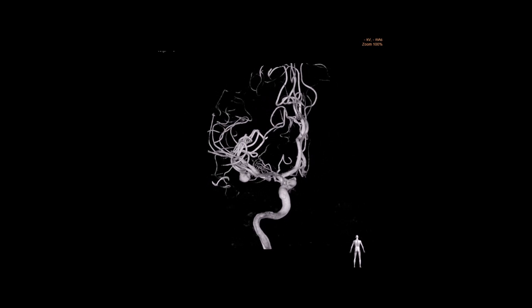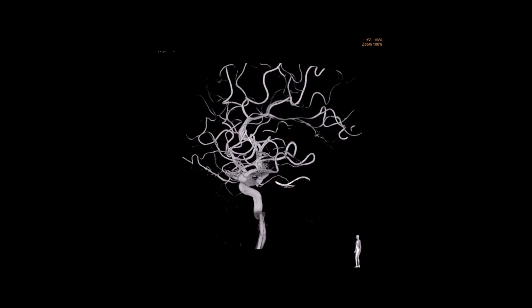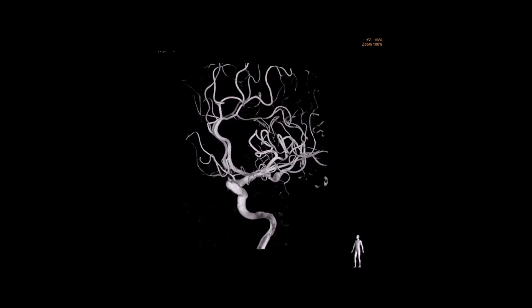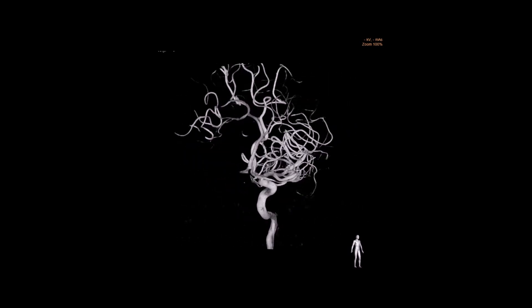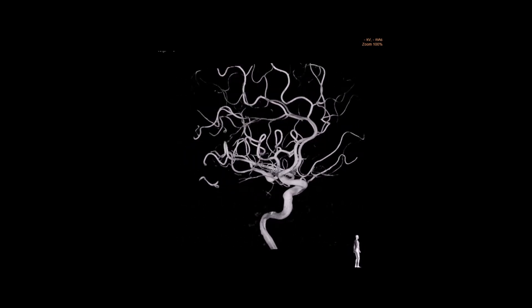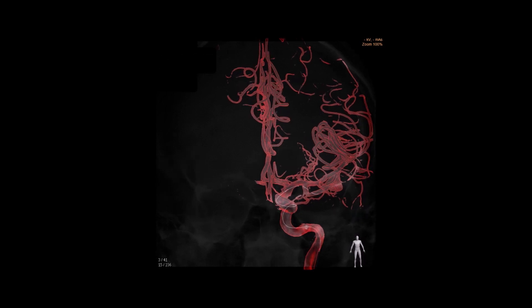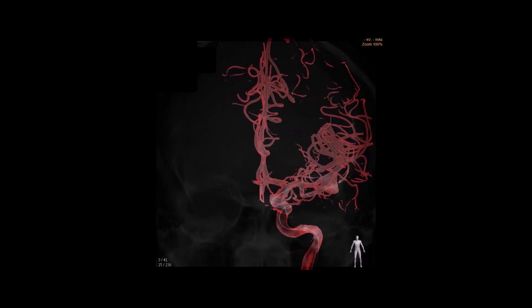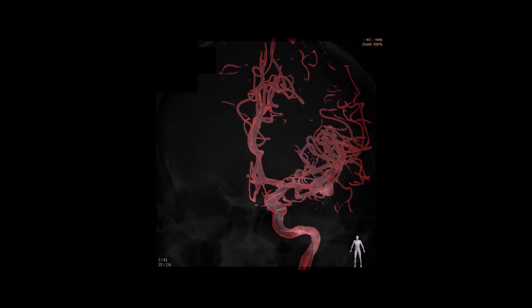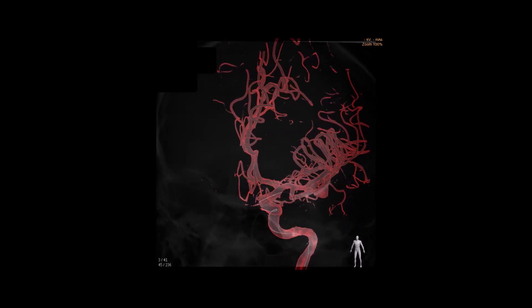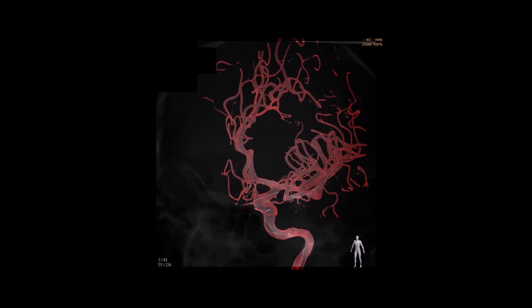The aneurysm was confirmed as distal, fusiform, and dissecting with no branches coming out of the aneurysm. An Envoy 6 French catheter was positioned in the internal carotid artery.